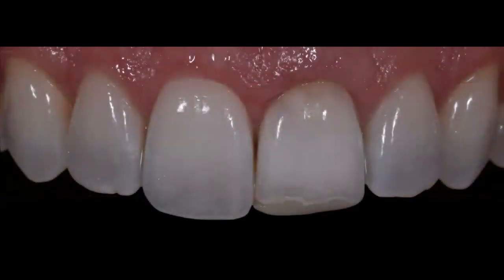At this point, this photo was taken after the root canal was completed. After the root canal was completed, there was also a small flap that was done by a periodontist on tooth number 9. This photo was still healing. You can see there's a little bit of an area here, right in the mesial gingival aspect of that interdental papilla. There's a little bit of healing still going on there. This photo was taken when that healing was going on.